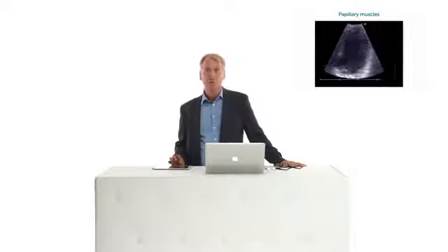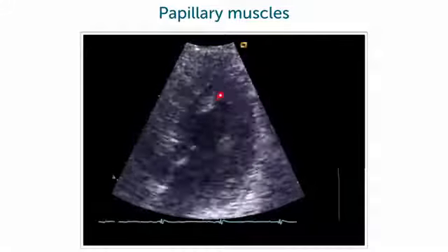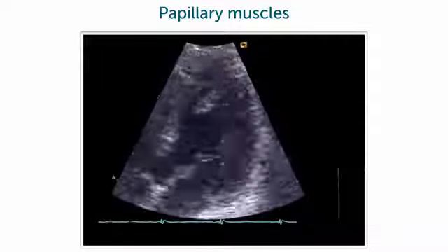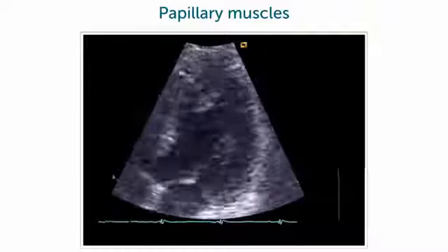And finally, one more pseudotumor, the abnormally positioned papillary muscle. In this case, it is positioned very far in the apex. But remember this image because tumors can look very similar to this. And if we see something like this, to be honest, sometimes we're not sure either.